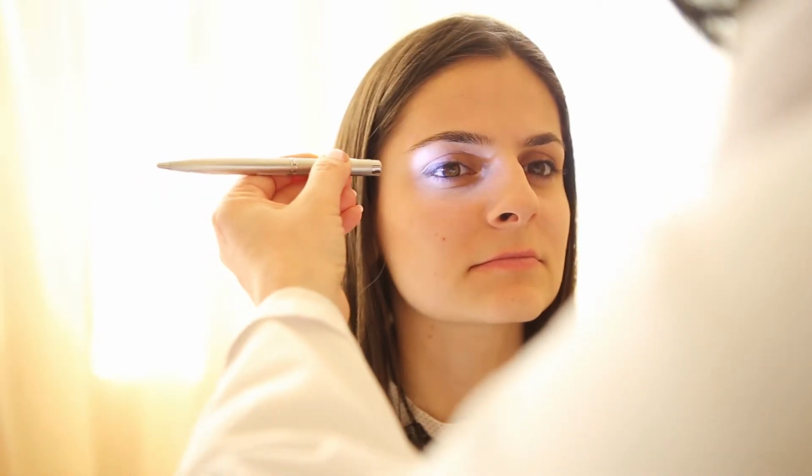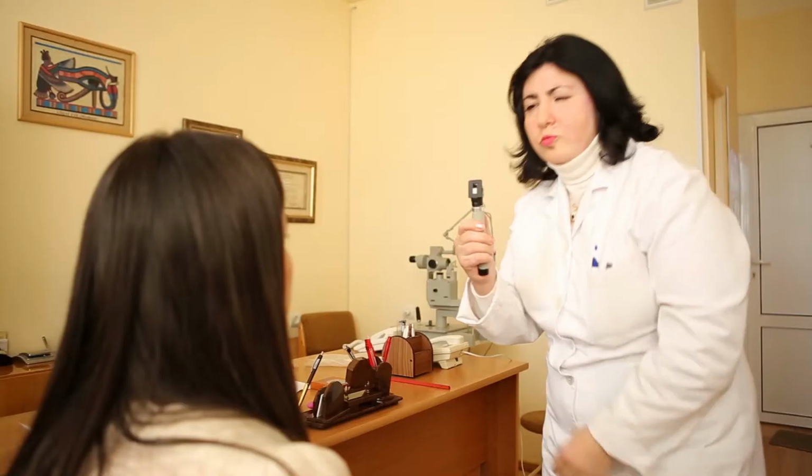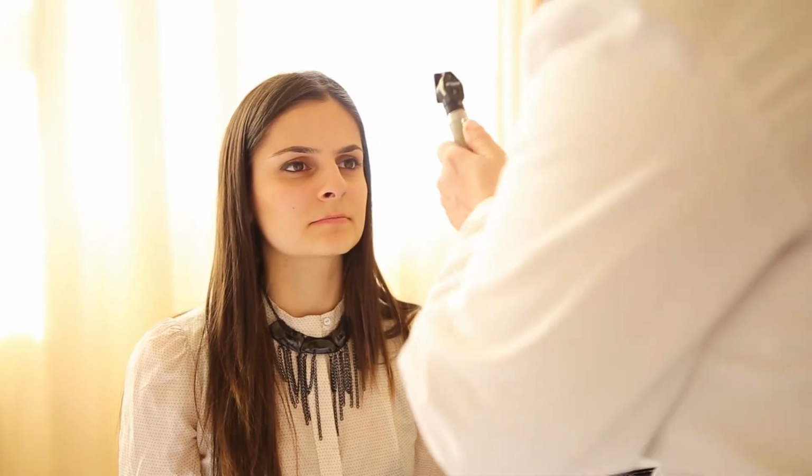Test the pupils for direct and consensual responses. Assess the anterior chamber for depth and clarity. Inspect the cornea and iris. Assess the lenses for clarity through direct ophthalmoscopy. Use the ophthalmoscope to study the fundus, including the disc, vessels, and macula.